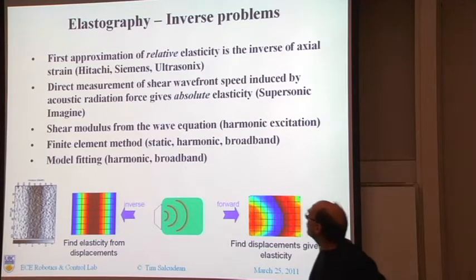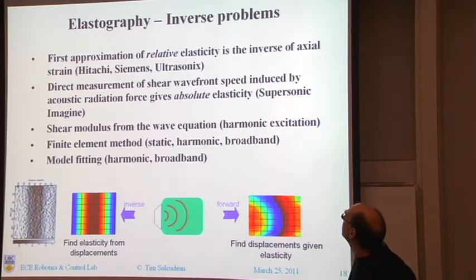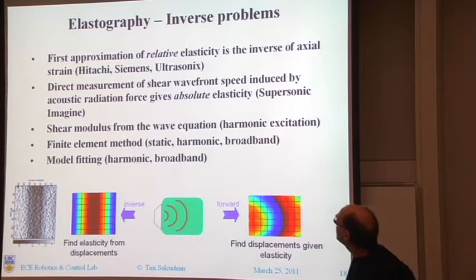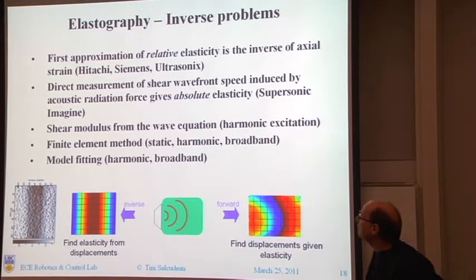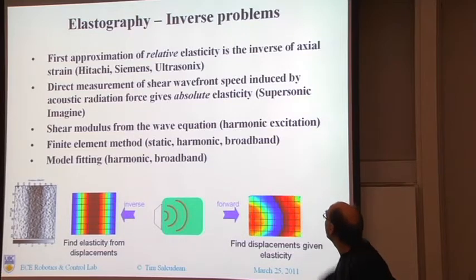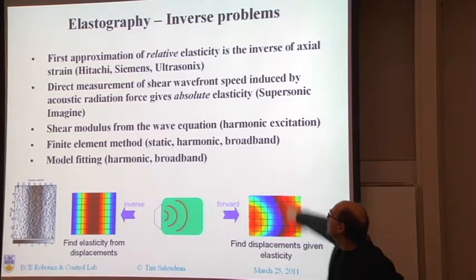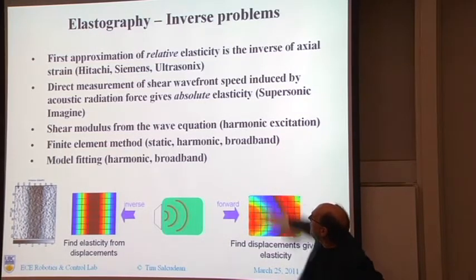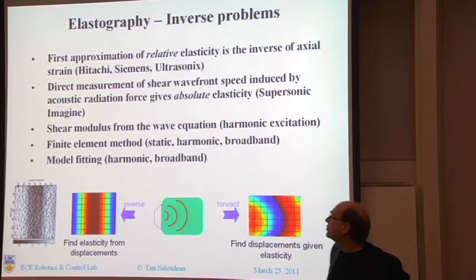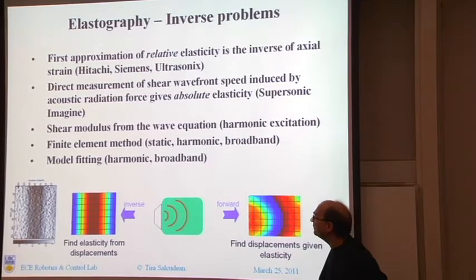You can also measure the direct shear wavefront of a wave that's introduced by the acoustic radiation force. This is the technique adopted by Supersonic Imagine, a machine from France. The shear modulus can also be obtained from harmonic excitation, or by inversion from the wave equation using finite element methods in the static, harmonic, or broadband approach. And we usually have a model fitting.